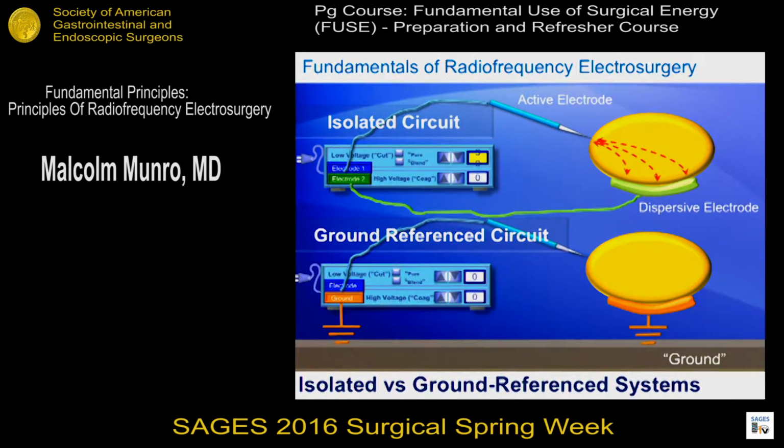Also, that type of circumstance allows the circuit to go all kinds of places, to physicians, to nurses, to beds, to electrodes on the abdomen or chest, and cause adverse events. So we really, since the 70s, have been using isolated circuits.